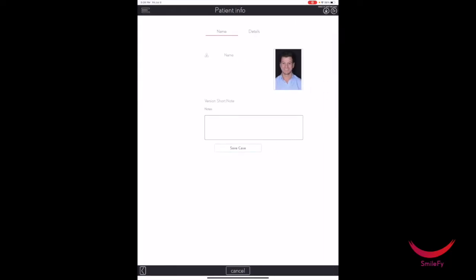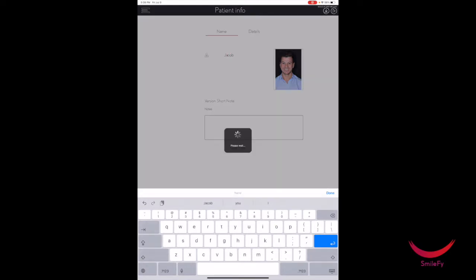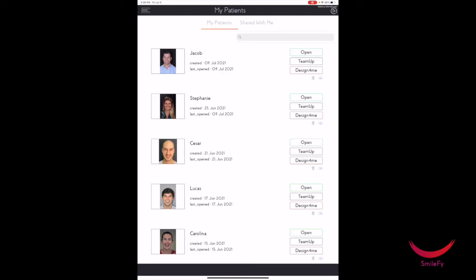Tap next. Enter your patient's name and save the case. Now, tap on patient list and select Design4Me.